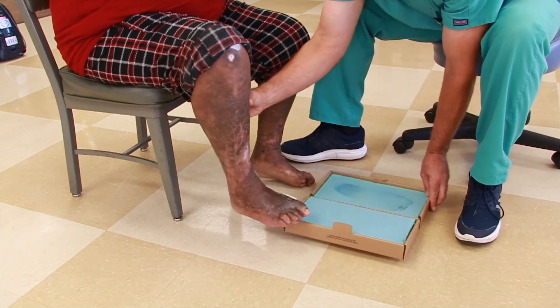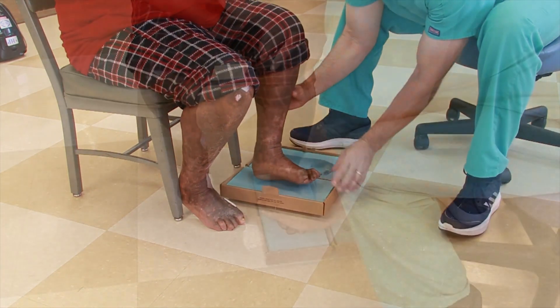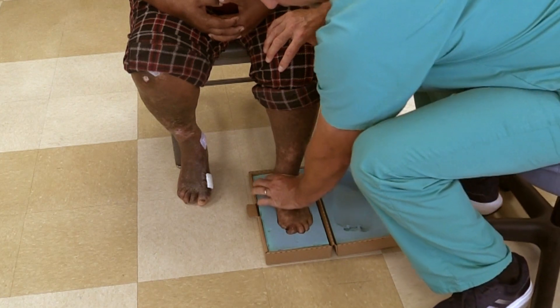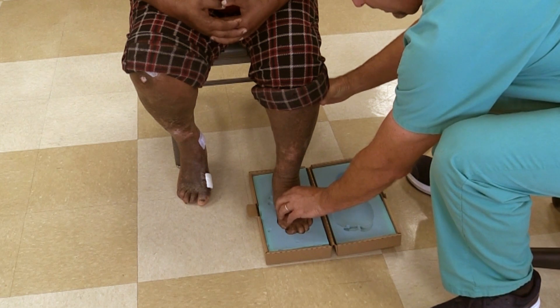Once you feel you have a good impression, lift the foot straight up and out of the foam box. Transfer the unused side of the box to the other foot and repeat the process. Again, apply firm pressure to the first ray in front of the ankle before lifting the foot out of the box.